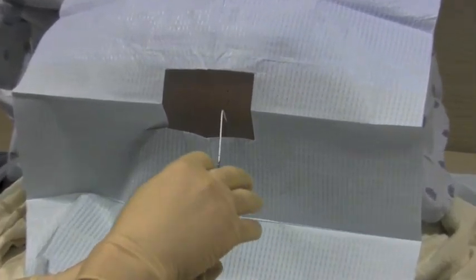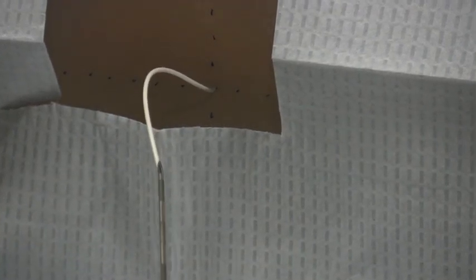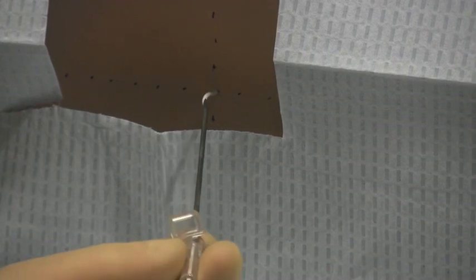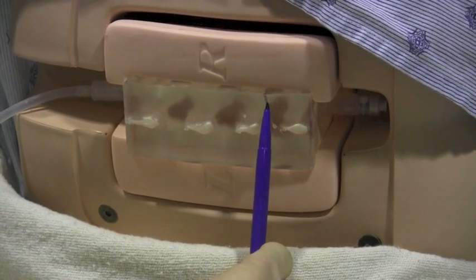Here I will demonstrate what should not be done. At no point should the needle be advanced along the catheter, nor should the catheter be pulled out against a stationary needle. Otherwise, we risk cutting the catheter off with the needle tip.